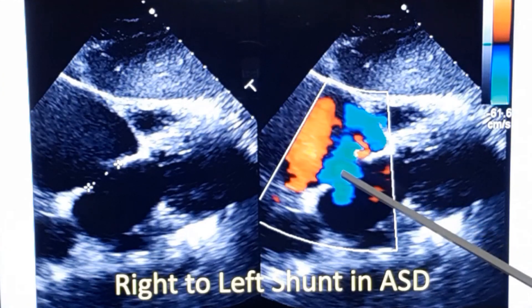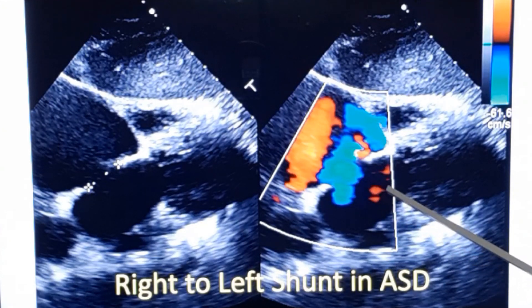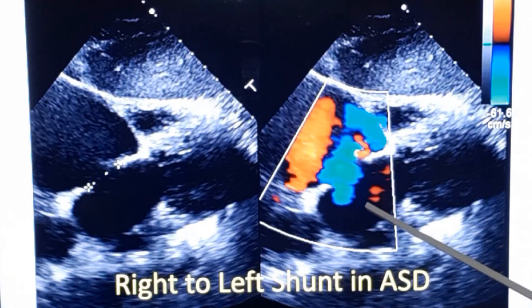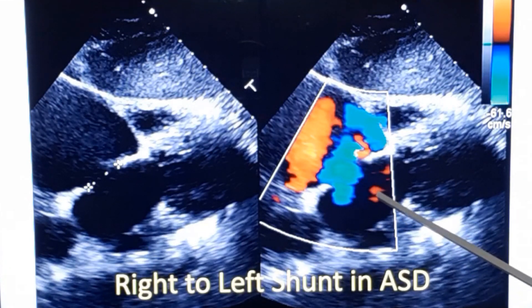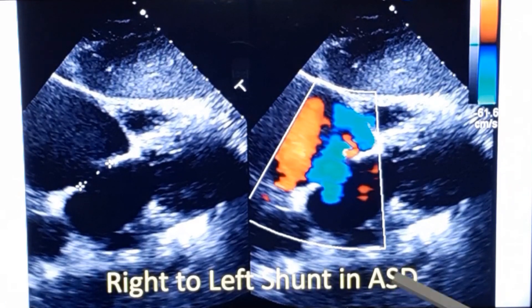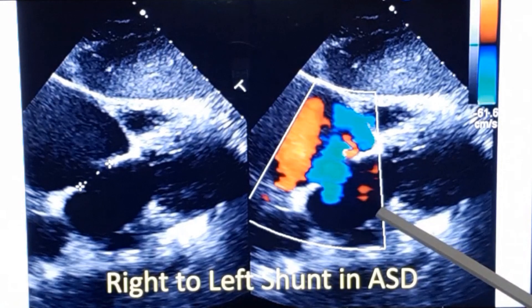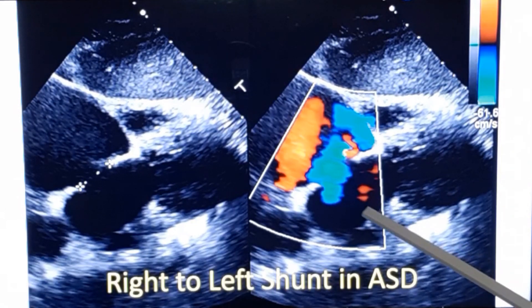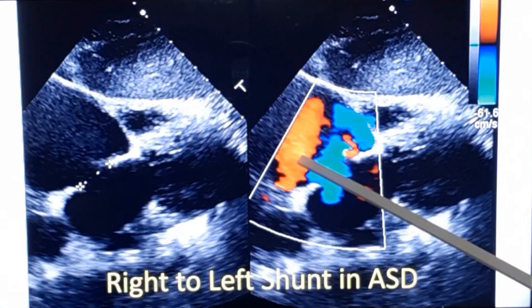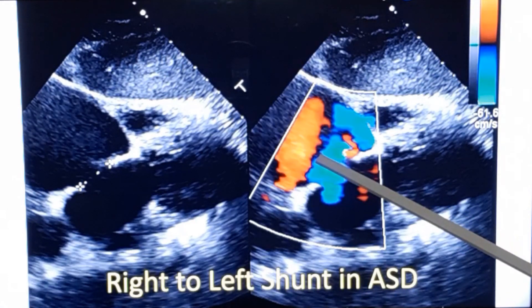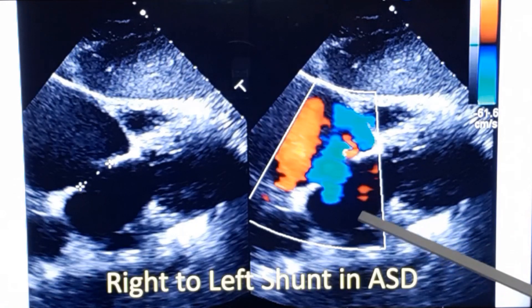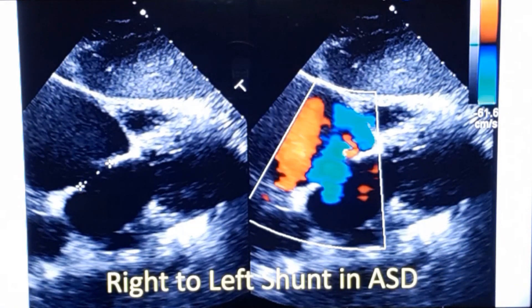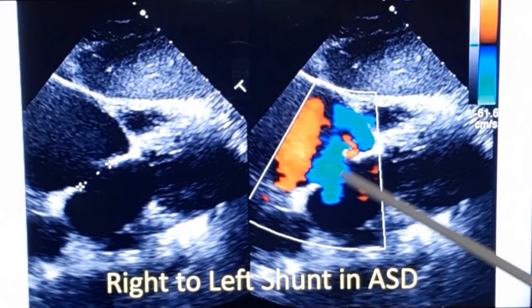Usually right-to-left shunt occurs in atrial septal defect with severe pulmonary hypertension — this is an Eisenmenger situation. However, in ASDs it is also possible to have transient right-to-left shunt when there is a slight pressure difference between the right and left atrium during respiratory phases. Transient right-to-left shunt need not be due to Eisenmenger syndrome, and this is one mechanism for paradoxical embolism — venous thromboembolism moving to the systemic side. A thrombus from the inferior vena cava can move into the left atrium and into the systemic circulation, producing systemic embolism.